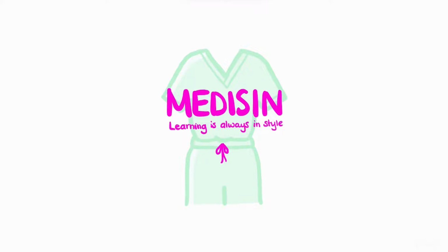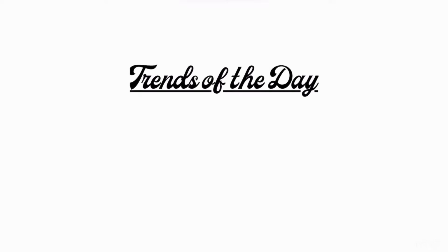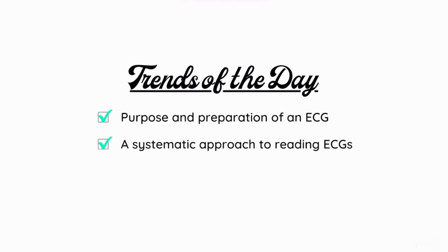Today, we'll be talking about electrocardiograms, or ECGs. By the end of this video, you will have an understanding on the following topics: the preparation of an ECG, a systematic approach to reading ECGs, and recognizing features of normal sinus rhythm.